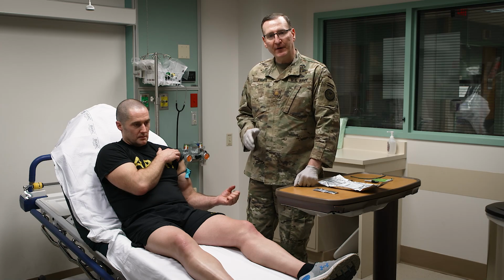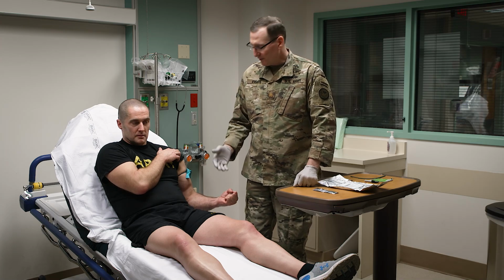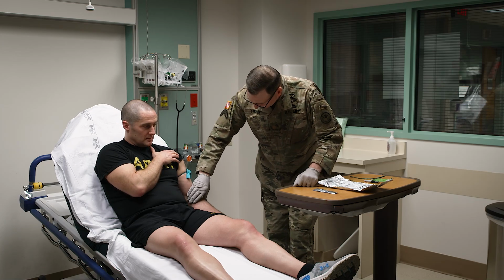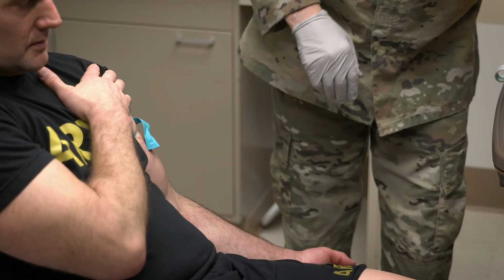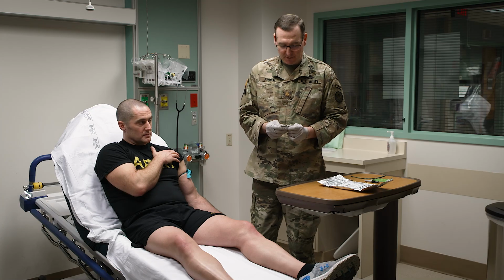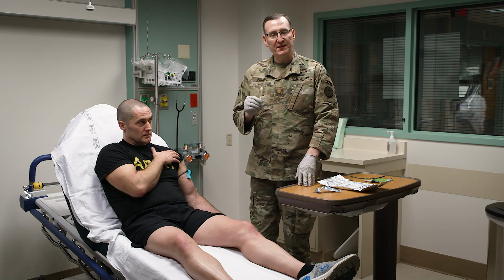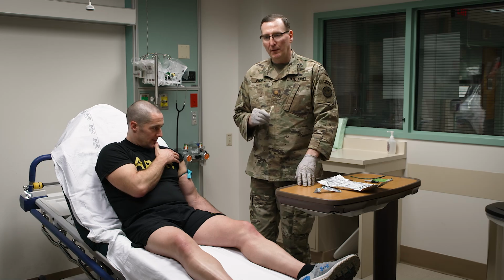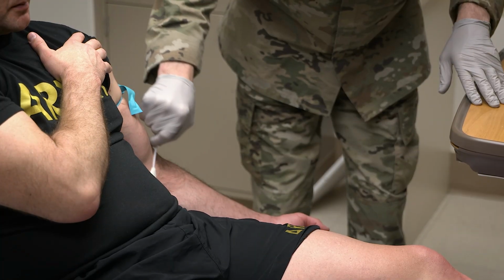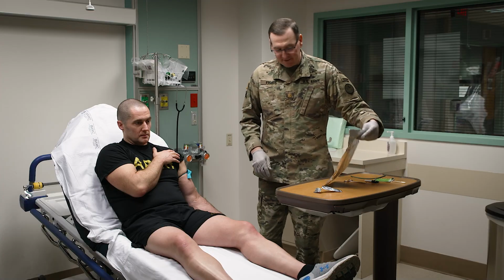You want to make sure you find a vein that can at least accept a 16 gauge needle. So most likely you're going to find that in the antecubital fossa. So we're going to start looking here. We can see several veins that are appropriate size. We're going to make sure we take a proper antiseptic swab and clean the area. Prefer that you use chlorhexidine or something similar beyond a normal alcohol prep. Once that is complete, just go ahead and let that dry.